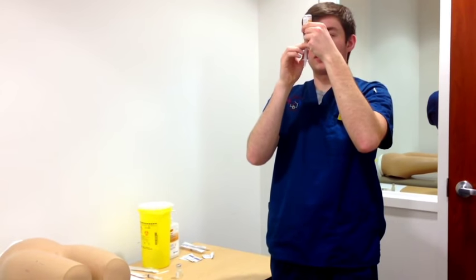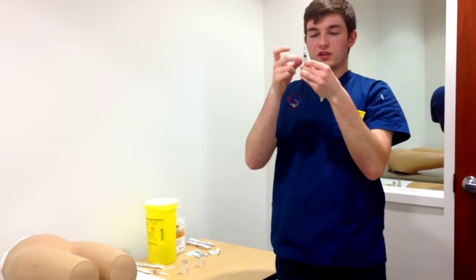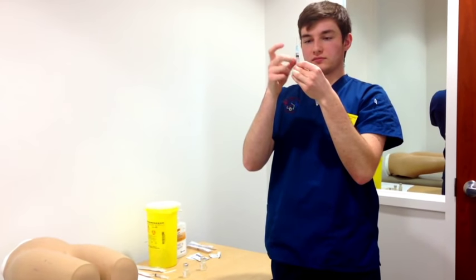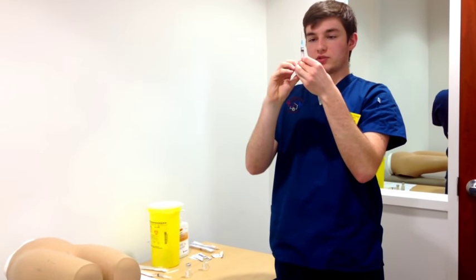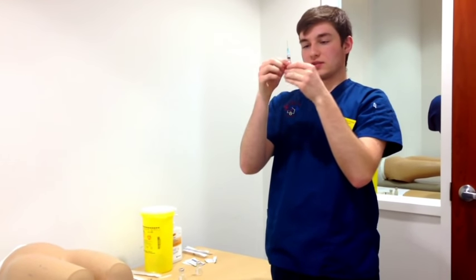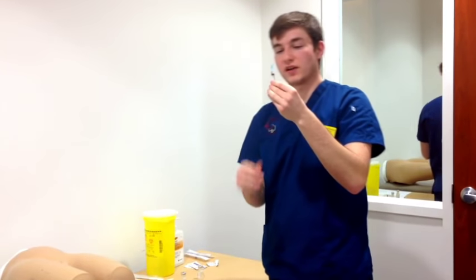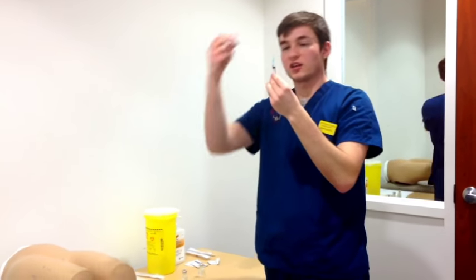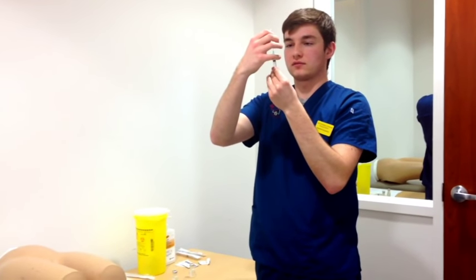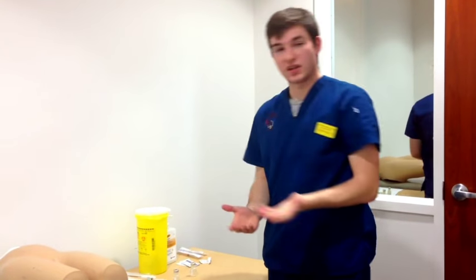Turn out the appropriate amount of liquid, it will then draw straight out. Flicking it to release any air. Just lightly pushing the plunger to get rid of any excess air that may be at the top of the needle. Excellent. Again, making sure I have 0.5 milliliters here, 0.5 milliliters onto the vial itself. Excellent. And put the needle back on straight. I prepare the medication for the client. I will then get rid of any garbage necessary and then move on to actually injecting the patient.